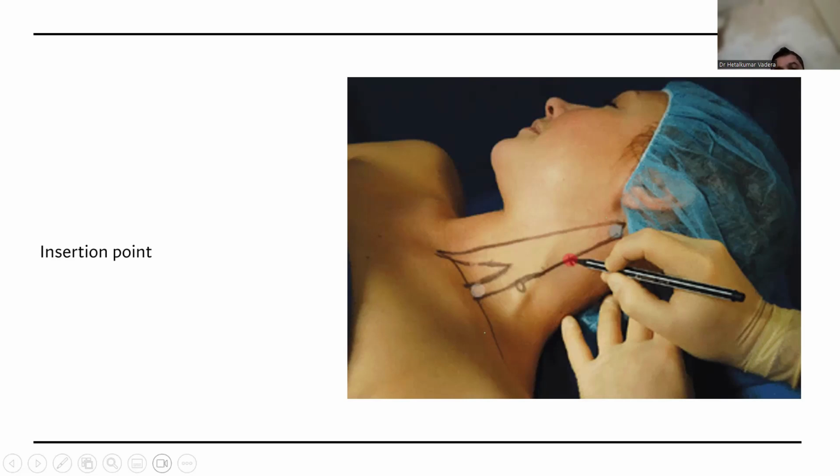So make the needle end open to the air and blood will come in a few seconds. If you aspirate, sometimes the vessel gets collapsed and you don't get blood inside the needle or in the extension tubing. So you have to be careful because this is a vascular area, and if you are using bupivacaine and inject intravascularly, there are chances of local anesthetic systemic toxicity. So these are the few points I want to add. Otherwise, it was an excellent presentation.